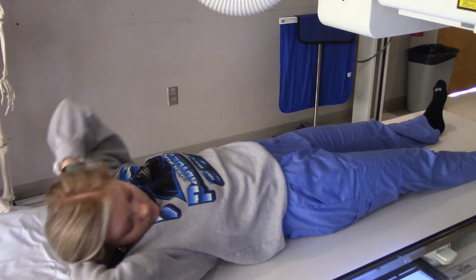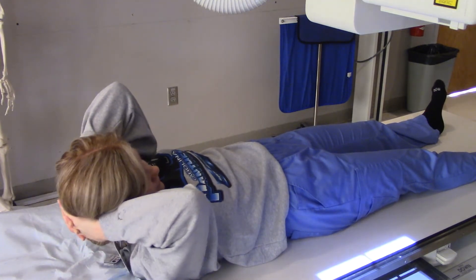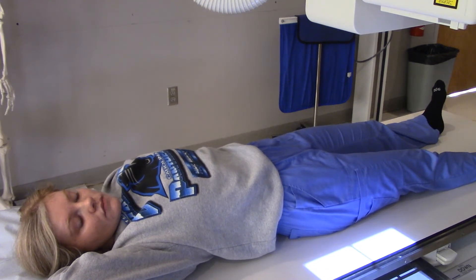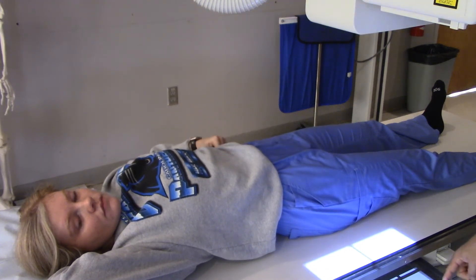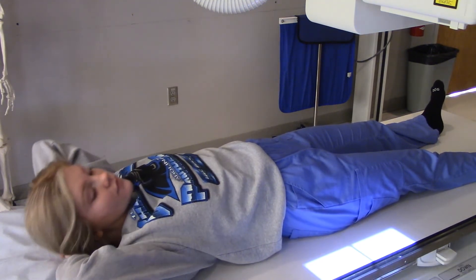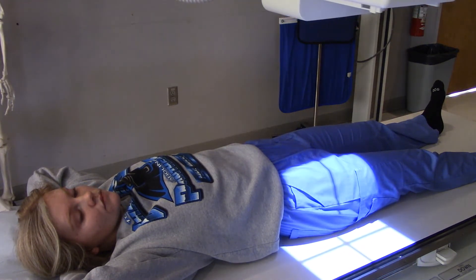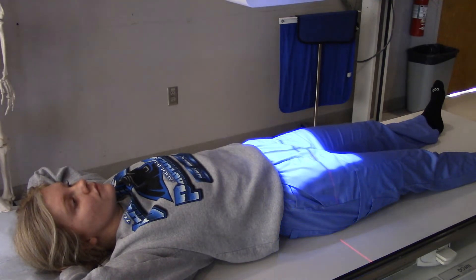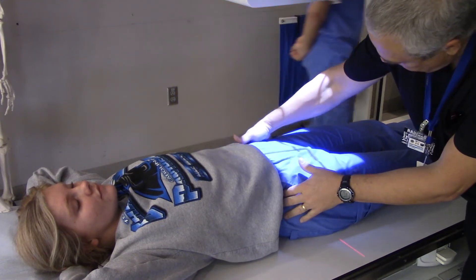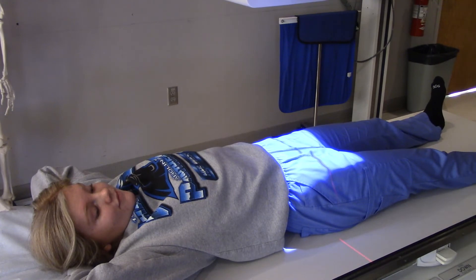There we go — now we're open to film size, guaranteed. We're centered here and we're opened out to the edges. Now I'm going to put this back where it belongs, being very careful not to change anything else, and just roll right back into detent. There we go — now we should be good.